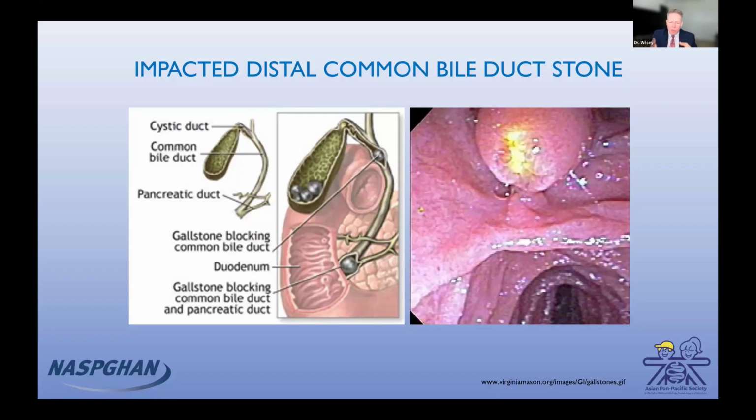When you bring the stone in, it's like a baby who is crowning, and there's so much excitement, and the outcome is uncertain. So we're trying to figure out how can we deliver this baby, this big yellow everlasting gobstopper that's stuck? Can we get a wire through? Can we do incisional therapy? Can we cut through freehand with a needle knife? Can we push it back manually and then get a balloon around it to pull it through?